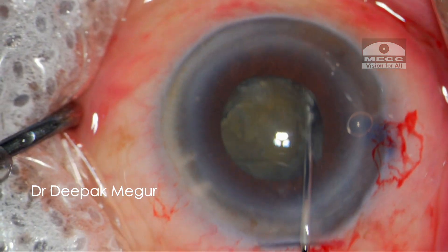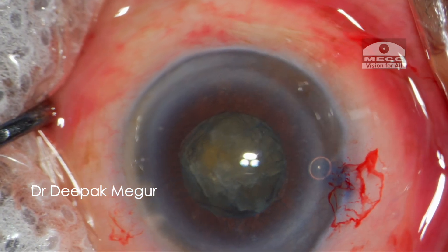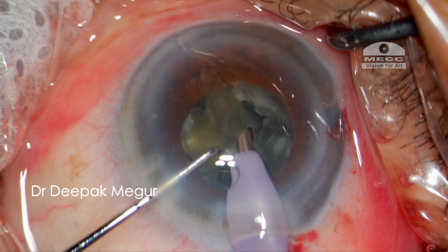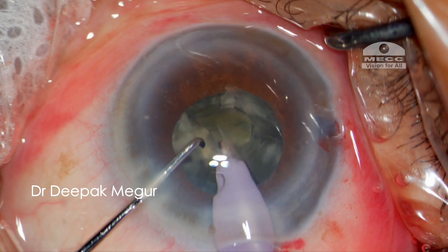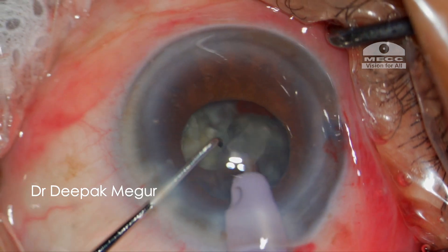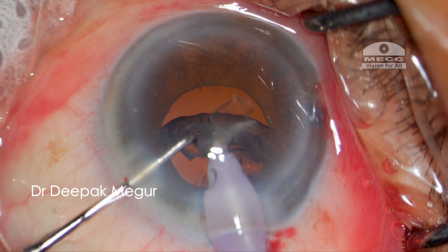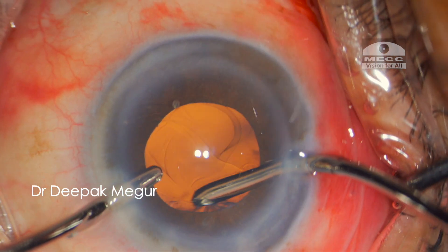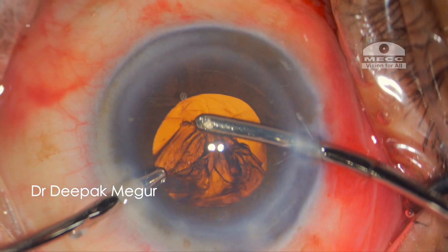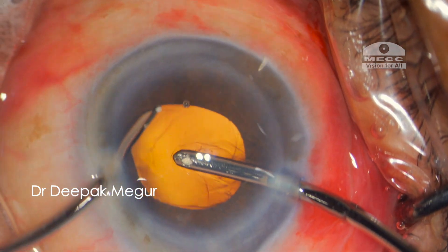Nucleus rotation is done by the cannula itself. We then proceed with emulsification and the nucleus could be emulsified quite easily. As the case progresses, we can see that the pupil has progressively decreased in size. In spite of the small pupil, we can appreciate a significantly decent amount of red glow. The cortex aspiration is done under the illumination of just the Omniglow — the microscope light is off here. The red glow is of great help in extracting out the cortex easily and with great safety.